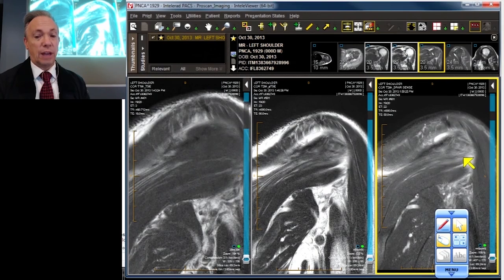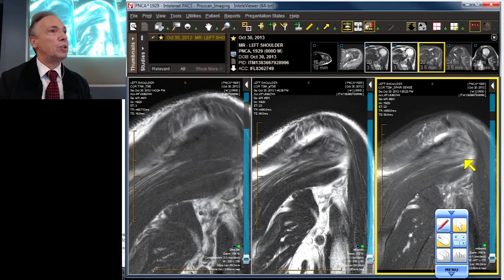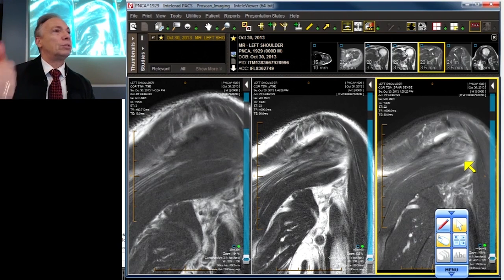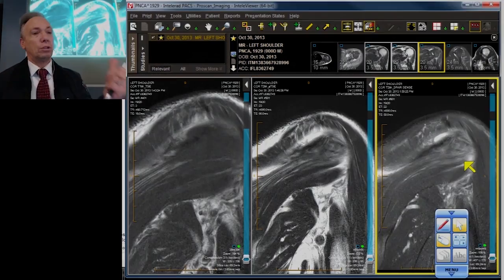Then we go to the teres, and we still have a teres — the good news is we have a teres. We have much of the subscapularis intact, with the deep fibers injured, but everything else is gone. We've gone through our checklist: supraspinatus — blown, retracted, complete. Infraspinatus — blown, retracted, complete from front to back. Subscapularis — deep fibers injured. Biceps — subluxed. Coracohumeral ligament — ruptured. Capsule — torn.